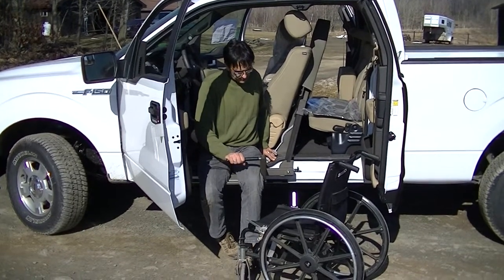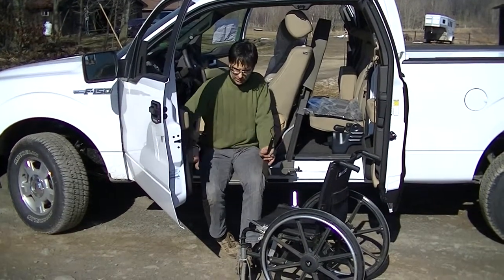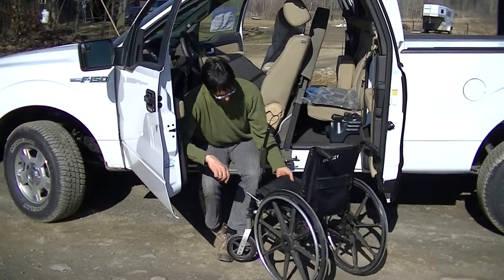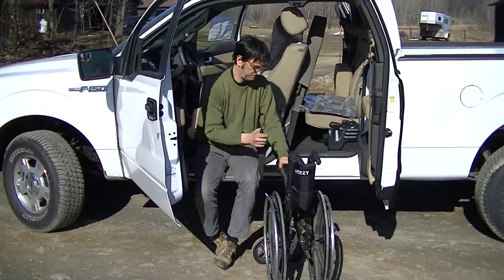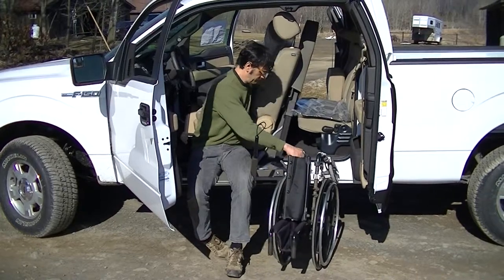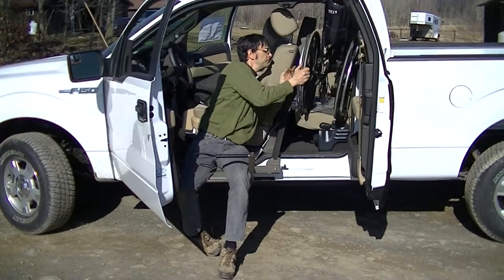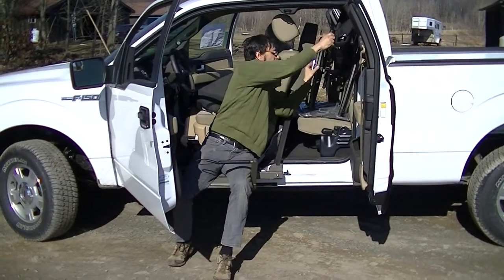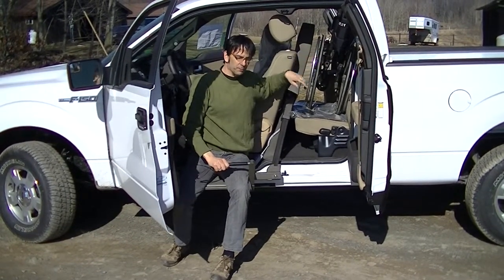This works for an X-frame but it'll also work for a rigid frame if the back folds down. Take the handle, collapse the wheelchair, and bring it up to the vehicle. We also have the easy stow power lift system available if you have trouble stowing the wheelchair.